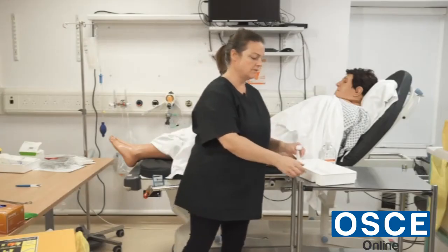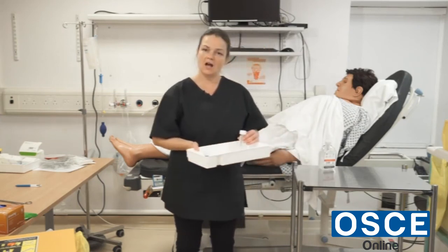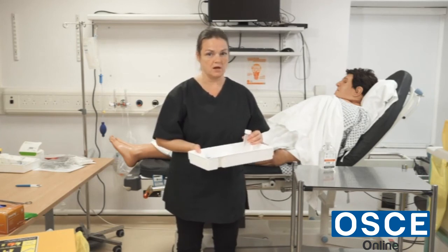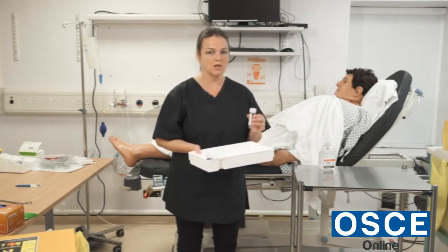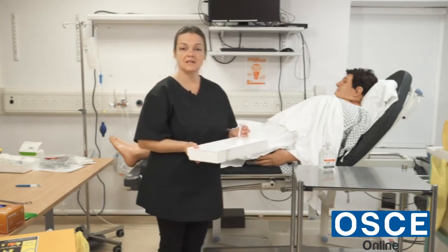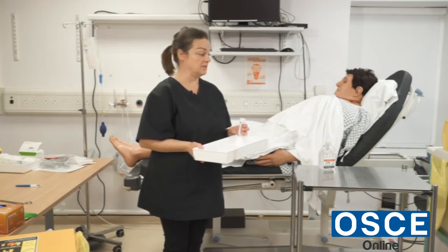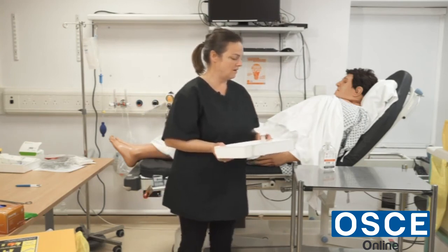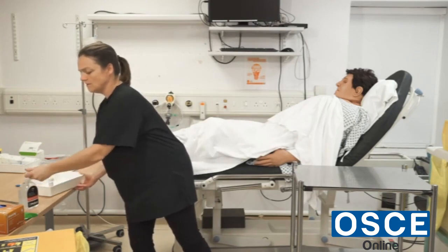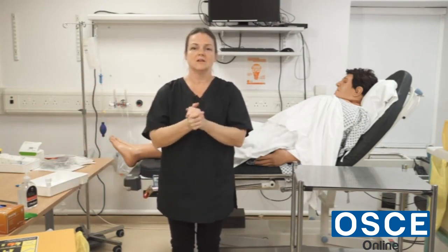I will now take the equipment away, get rid of the tray to clean it and the clamps. I would write in the patient's notes that I've taken the sample, give them the buzzer, and tell them I'll come back to see them within an hour or two, and to use the buzzer if they need us before then. I would gel my hands — that's the final part of the procedure — and that is urine sampling.